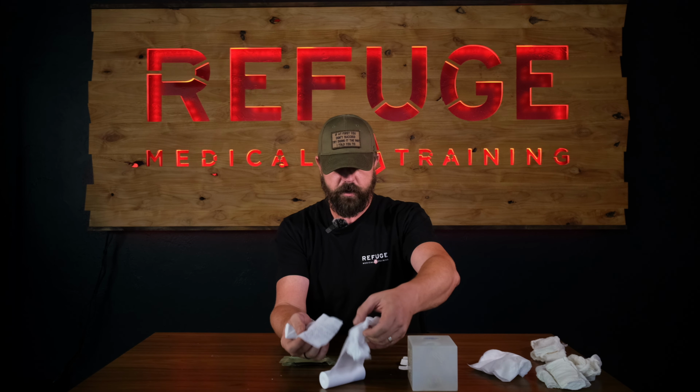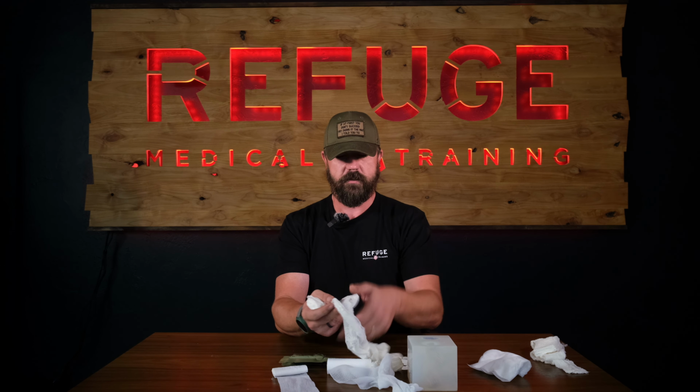This one is rolled, and you can tell the texture on this. I'm not sure how well it shows up on the camera here, but you can tell that it's the same thickness as this gauze, but it's got a sheen to it. It's a little smoother, and it's definitely not as coarse as this, but even this has that texture of the woven gauze material. This is a little bit sleeker. Still holds, still gauze. It just has that hemostatic agent impregnated in it.